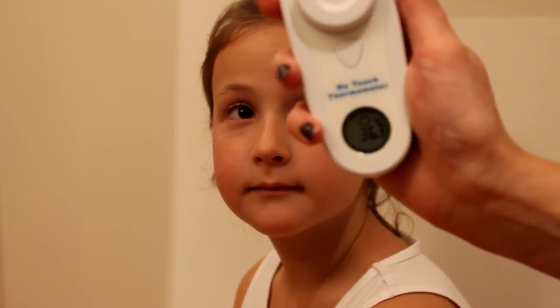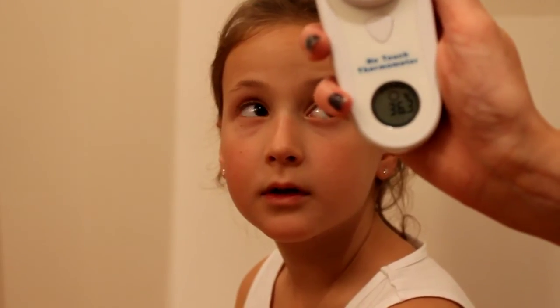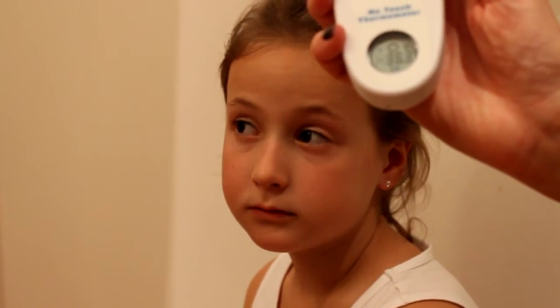Close the shutter to switch off the blue light. The screen will switch off after a minute — no need to press any buttons to switch off the thermometer.